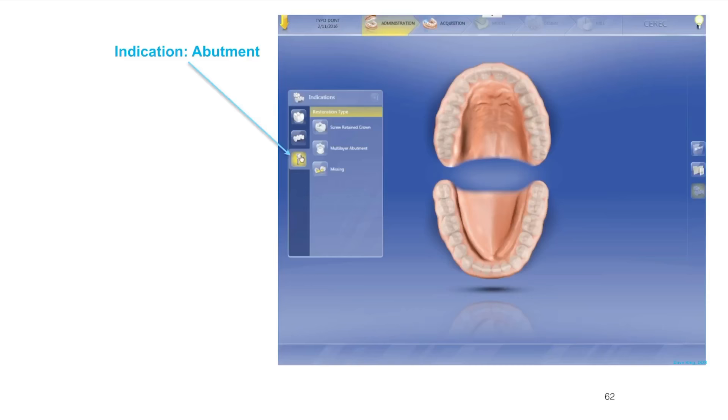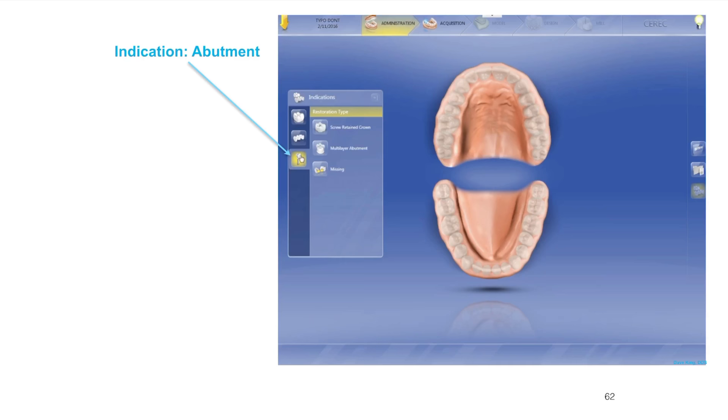Welcome back. Let's move forward into the administration setup phase of setting up a restoration in the CEREC 4.4 version software for implant restoration. The first thing we have to choose is the indication. This is assuming we've already set up our patient as you know from using the CEREC before.